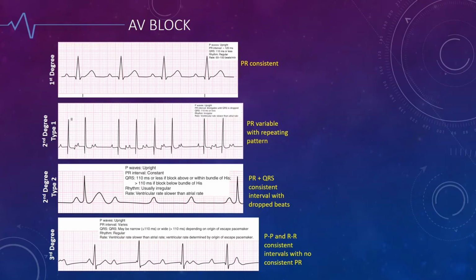Third degree heart block is the next one you should learn because it's the easiest one to separate. And then if it's not this and it's not this, then you just have to figure this out, okay?